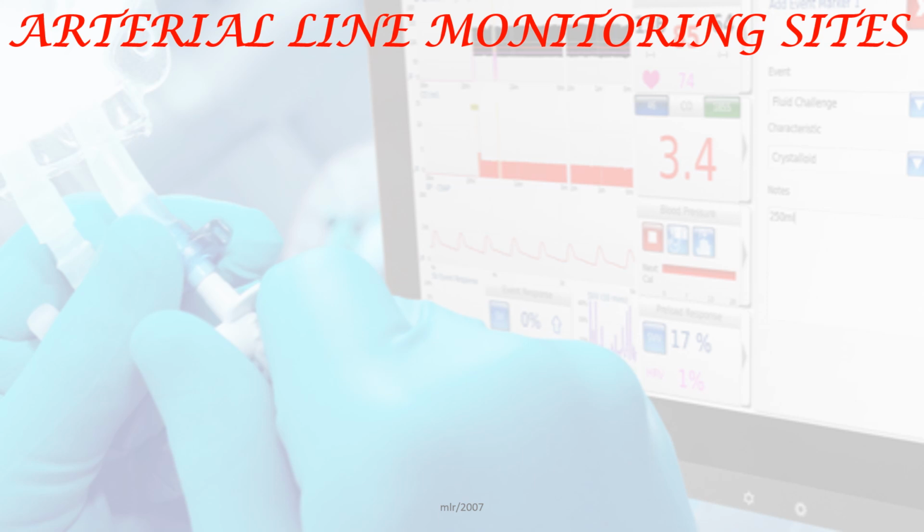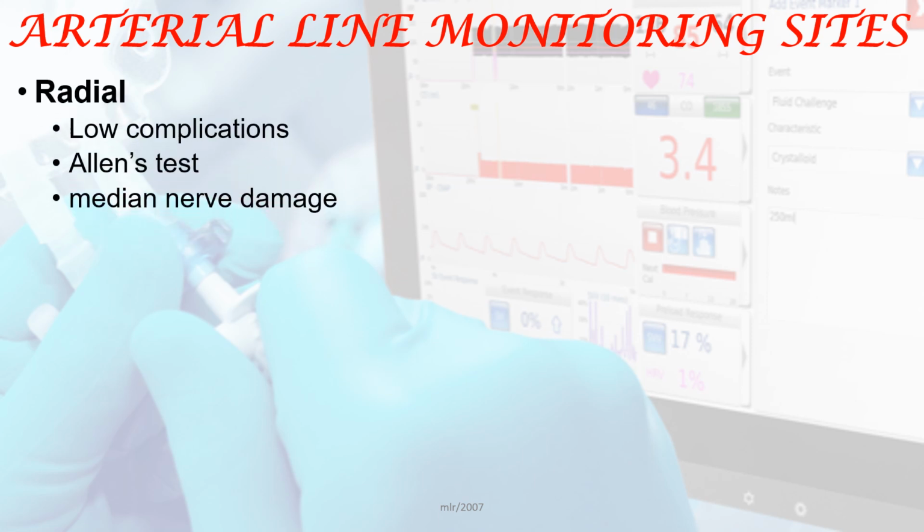Then, arterial line monitoring sites. The first one is the radial artery. The radial artery has low complications, and here we are supposed to perform Allen's test beforehand. Allen's test is used to determine the patency of the ulnar artery. Why? When we puncture the radial artery, there is a chance of damage to the radial artery, so to maintain the peripheral perfusion, we should make sure the ulnar artery is patent.